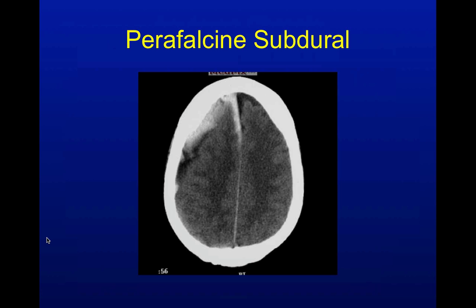Sometimes the subdural will move along slightly different paths. Here it is along the skull, but it's also moving along the falx. So there's hematoma on this side but not on the other side. A lot of this ends up being pattern recognition — once you've seen it, you'll recognize it again.